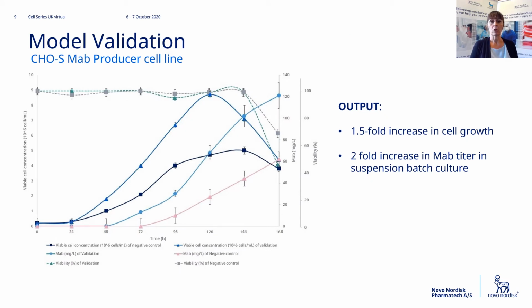Now, following the DoE approach, optimal conditions were validated against a negative control, CD media without supplementation, and cell growth and cell productivity were measured.